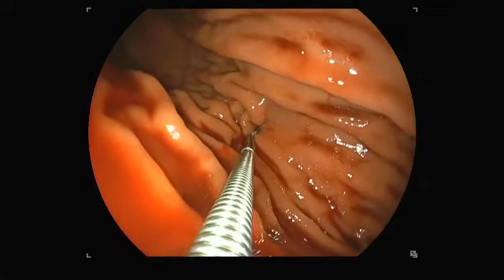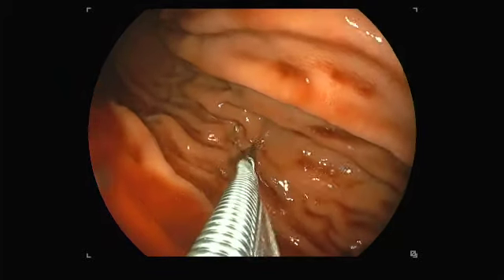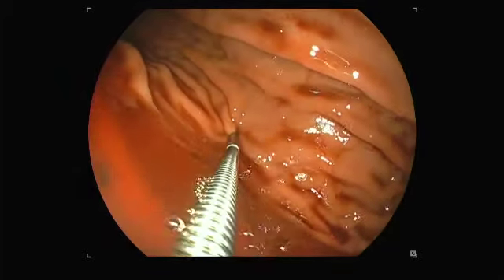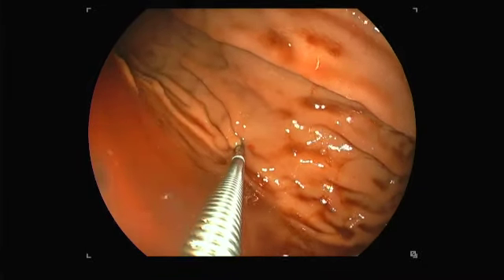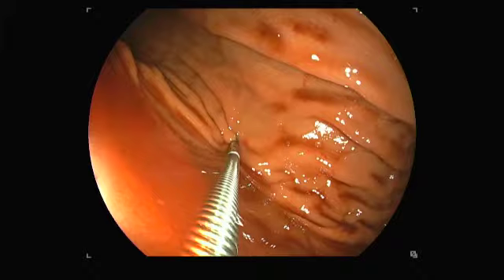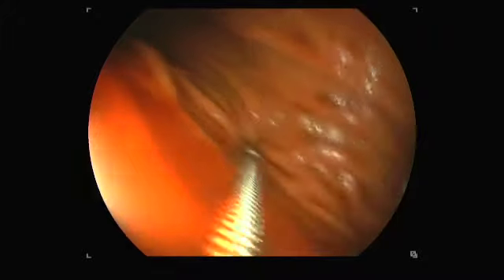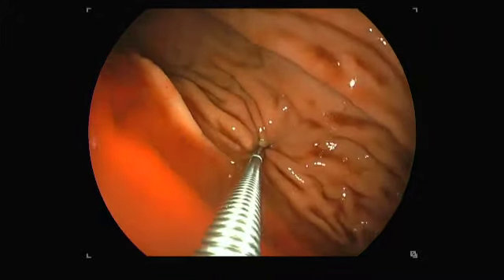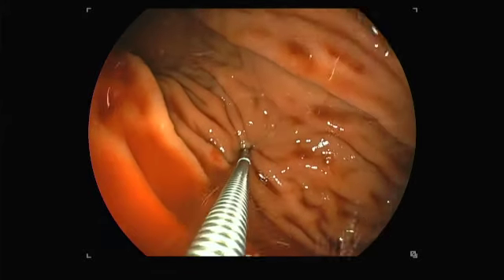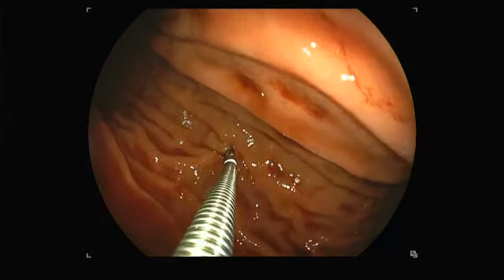We transfused to 35,000. His white cell count was in the 200 range. After extensive discussion with the oncology team, we felt that the benefits outweigh the risks of doing endoscopy in a severely immunocompromised host. In terms of management of this bleed, you have several options.